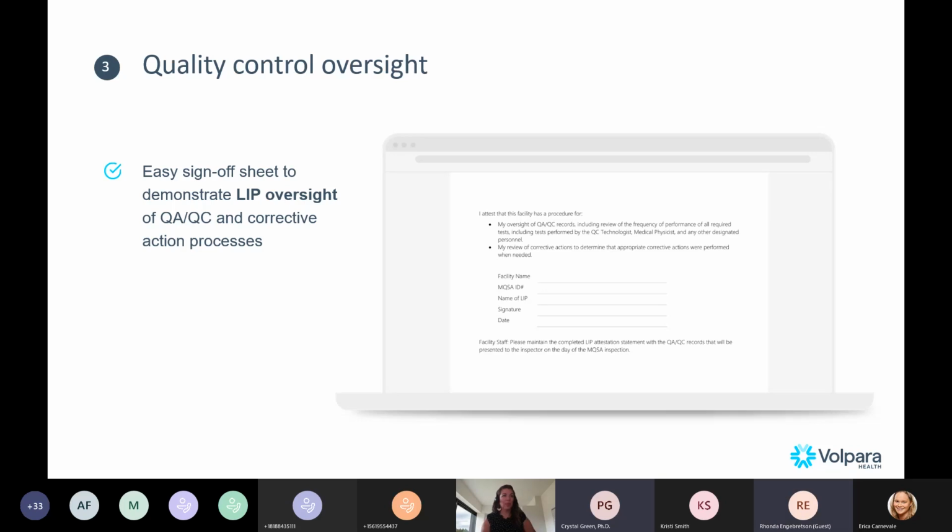Yes, you know what? I do use this. I do print this off. And so when my radiologist does look at my EQIP, he will sign off on this. And then for our 3 sites that we have identified with the ACR.